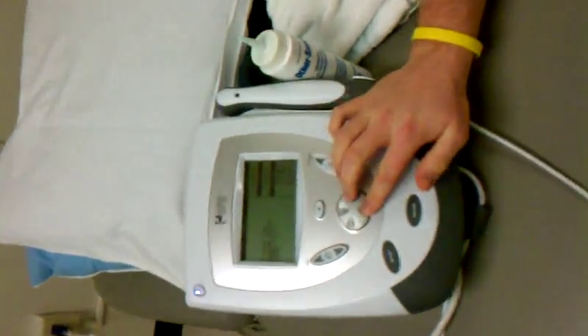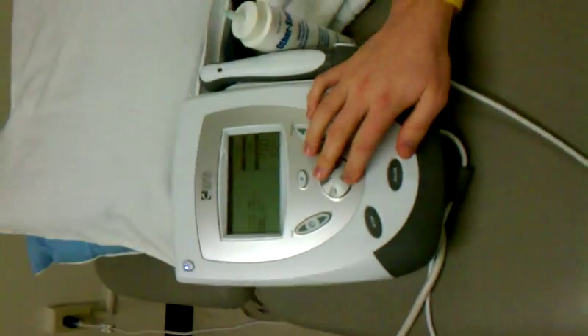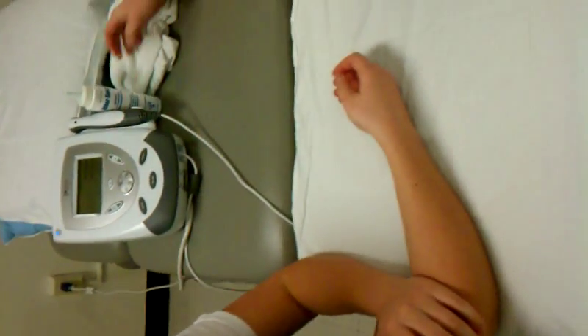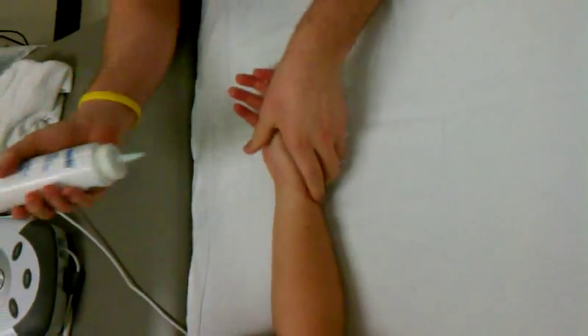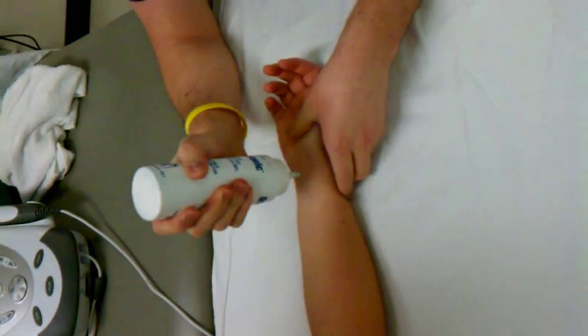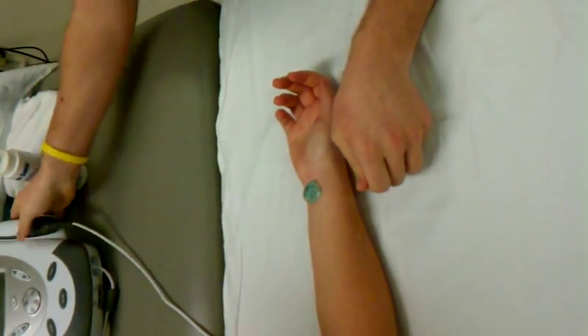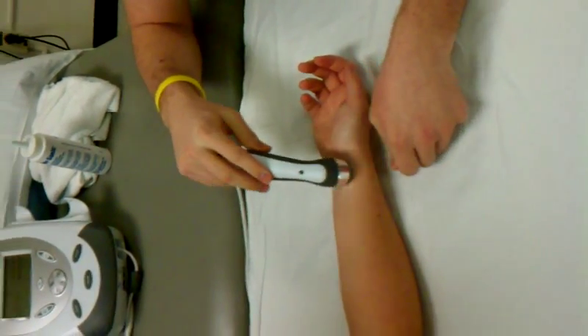And you've had this for a while, right? Yes. You've had the issue going on for two years, I see? Yep. All right, I'm going to get you all ready. I'm going to start this and we're going to get that intensity up.